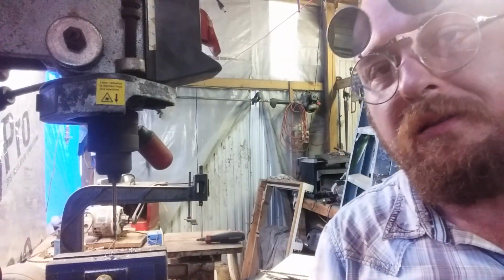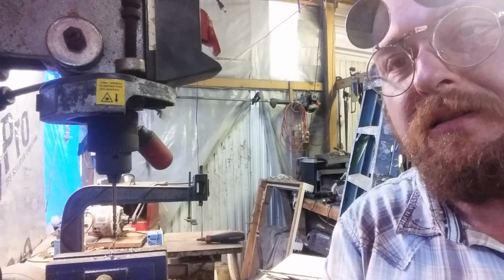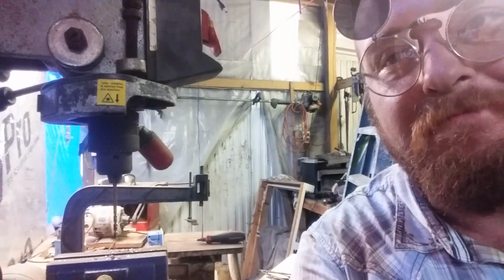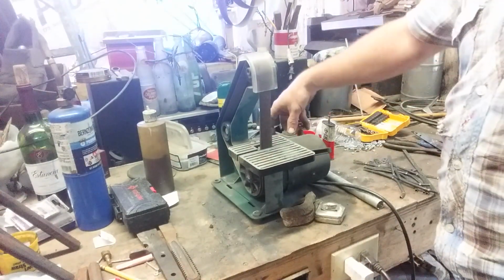Alright, we'll get back to this project here in a sec. I'm going to drill all these holes and we'll go over to the belt grinder. See you in a minute. Alright, let's clean it up a little bit.